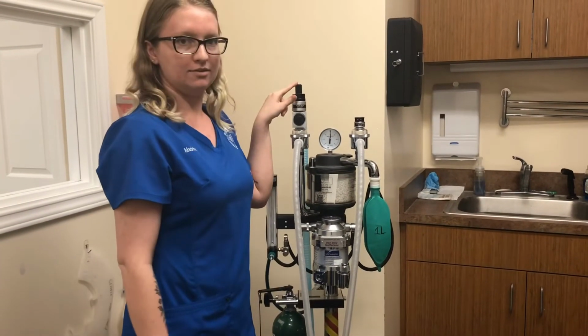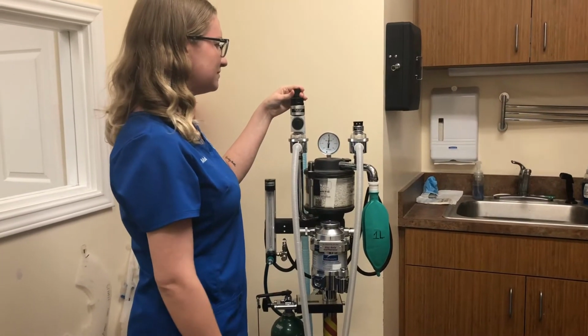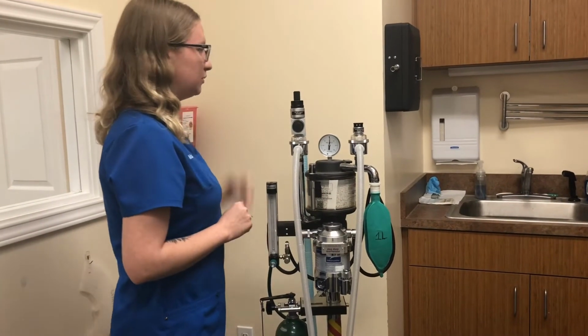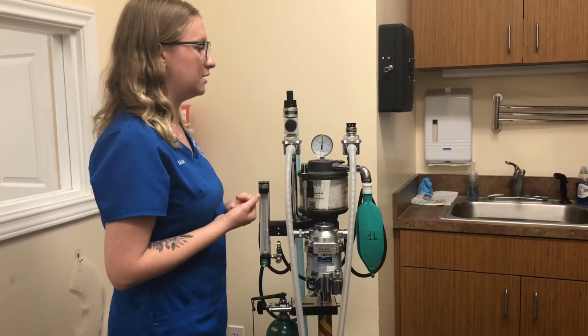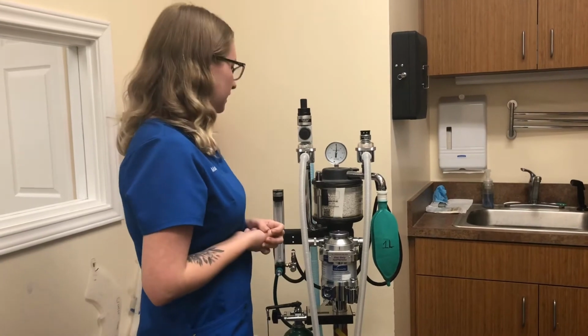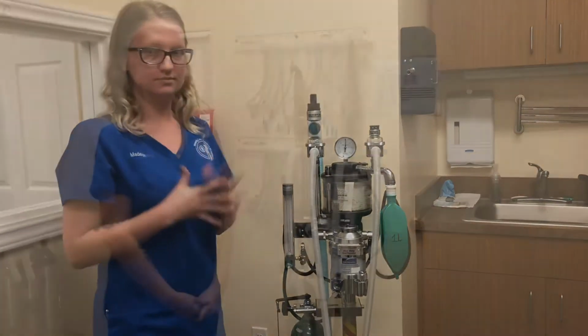This is the pop-off valve. It closes so that you can leak test your machine and have everything pass through, and then you open it back up to let the pressure release. You always want to remember to open this back up, otherwise pressure can build up and expand the lungs too much. It could even cause death in your patient. So yeah, that's our anesthesia machine as a whole.